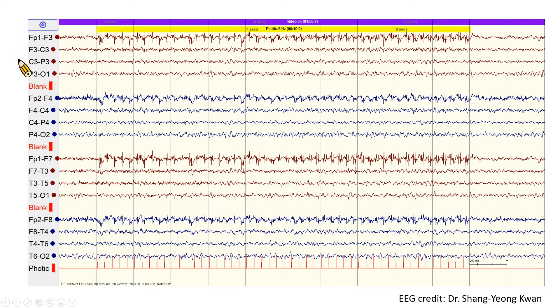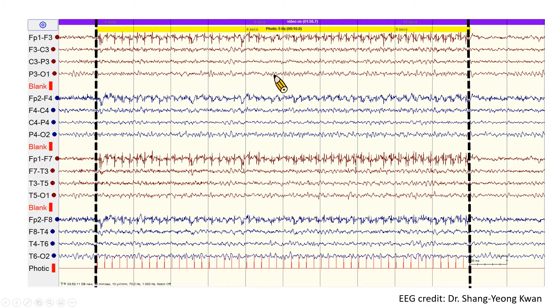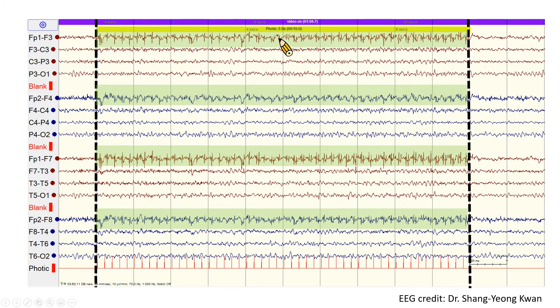This is a double banana montage EEG. Here, a beautiful photomyogenic response is demonstrated during IPS at 5 Hz. We can see frontalis EMG potentials over bilateral frontal polar regions, which are time-locked to the flash stimulus. The photomyogenic response starts when the flash stimulus begins and immediately ceases when the stimulus stops.